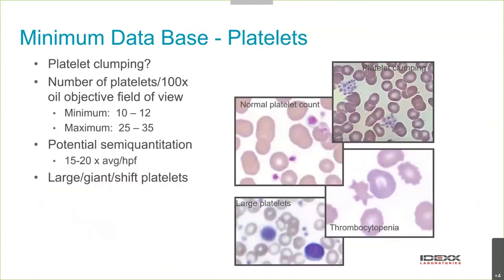Looking at platelets — they're the ones most affected by clumping, which is where a blood film is important. Seeing platelets clumped tells us the count is higher than what the machine reports. On oil objective at 100x, we'd hope to see at least 10 platelets per high-power field in the monolayer. Large platelets indicate immature platelets in circulation, or conditions like Cavalier King Charles congenital macrothrombocytopenia — where there's a low platelet count but larger platelet size, so total platelet mass is normal and they don't have signs of bleeding.